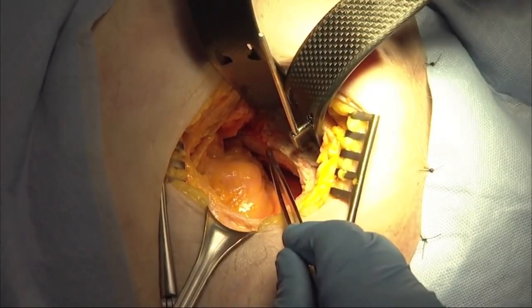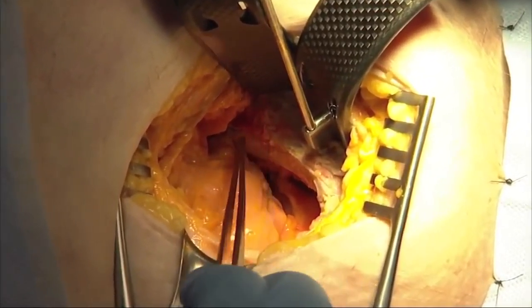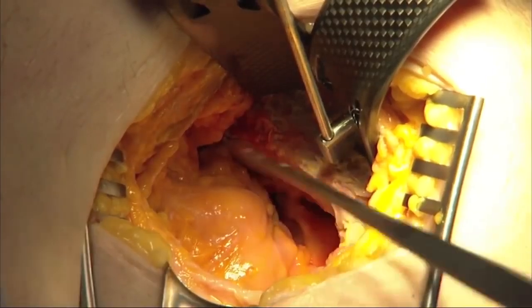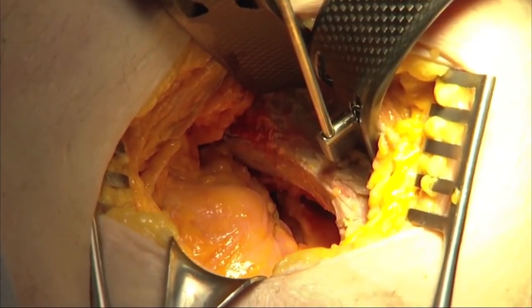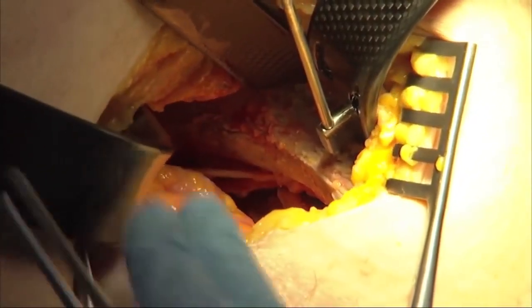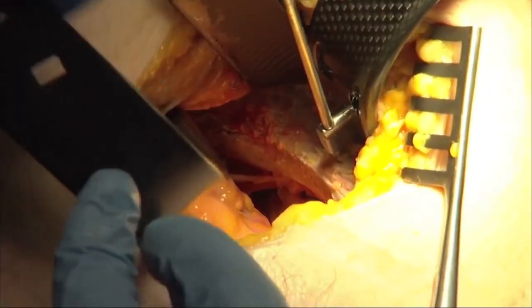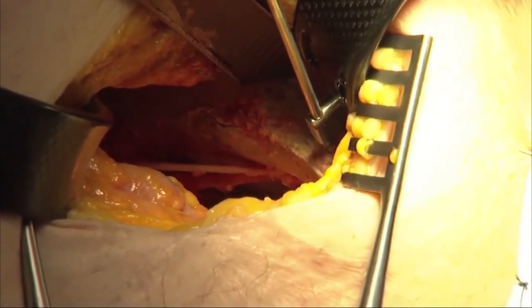The acetabulum, the hip socket, is right underneath this bone here. This is the pelvic brim, and what we want to do is keep working our way posteriorly in this section, and as we do that, we're going to get in underneath the iliopsoas muscle, which is back there. This is very important, not just for visualization, but also for safety. To get as far back as we can, we need to lift the iliopsoas muscle out of the way, and this will allow us to see right back to the lateral portion of the sacroiliac joint.